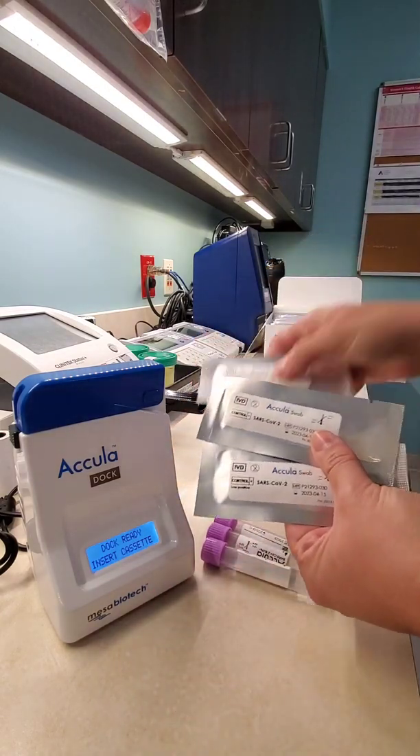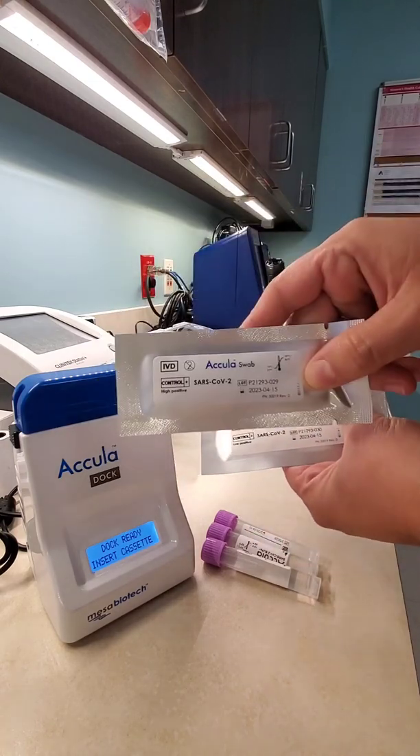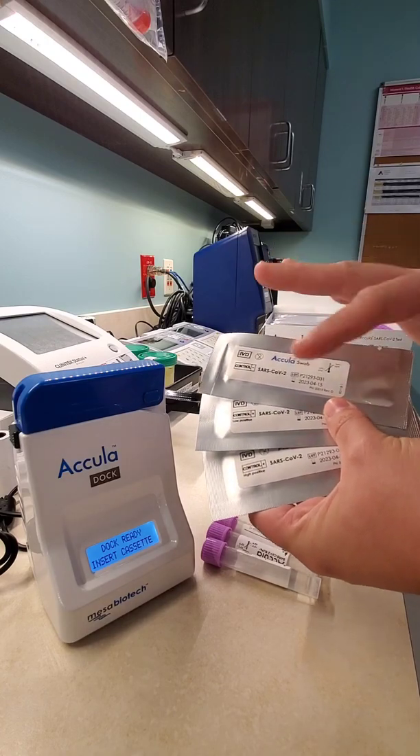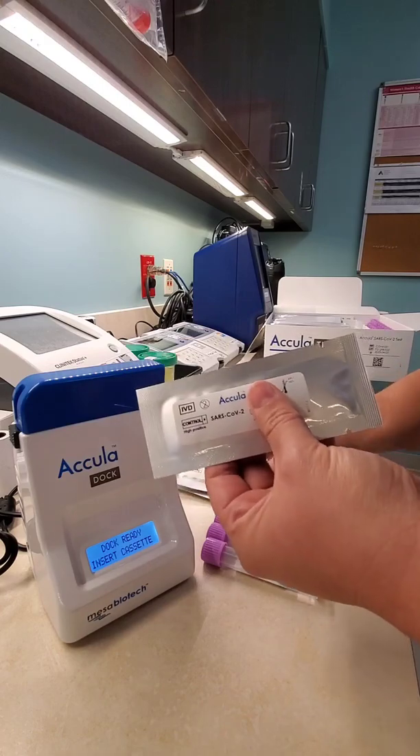The QC comes with three — we're used to having two, but now we have three. There is a low positive, a high positive, and a negative. So you have to do all three. I don't think it matters if you do positive or negative first like it is on the Sophia, but I'm just going to do the positive first. So I'm going to start with the high positive.